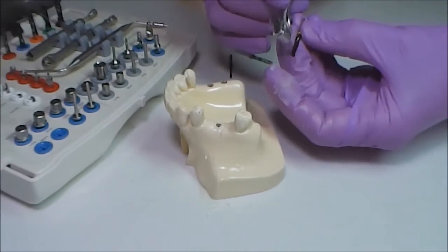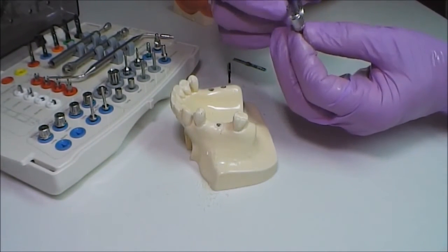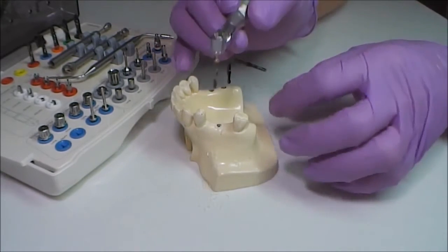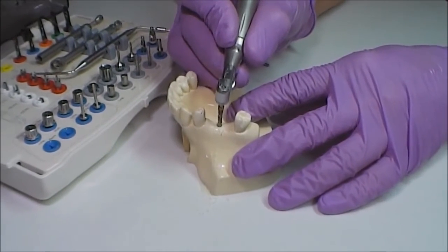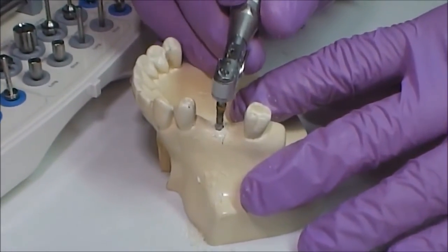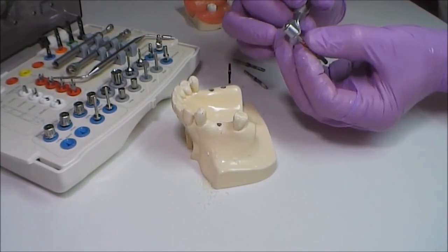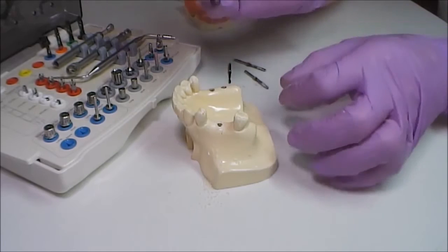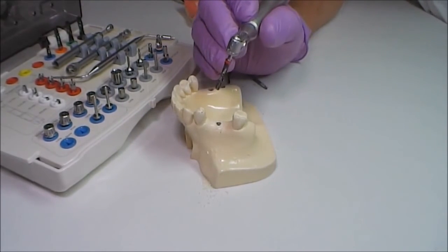The next drill is 3.0 millimeters in diameter. Drilling with it makes possible the installation of an implant with a minimal diameter of 3.3 millimeters. The next drill is 3.5 millimeters in diameter; drilling with it makes possible installation of a 3.8 millimeter diameter implant. Don't forget to decrease the number of rotations.